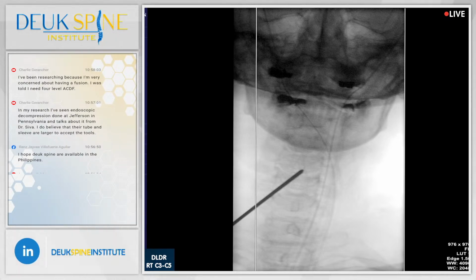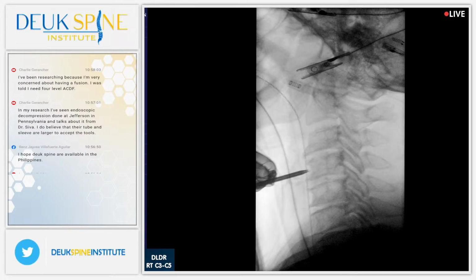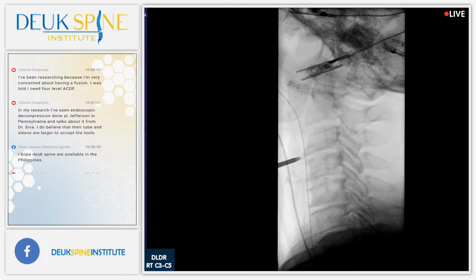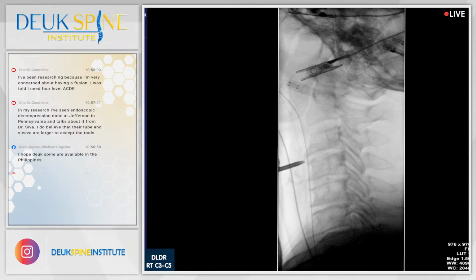Anyway, I learned from them and became probably the 3rd or 4th or 5th anterior cervical endoscopic surgeon. And at the time, Sang-Ho Lee in Korea and Germany were only doing 1 disc at a time. All right? They wouldn't do 2 discs, because they didn't know how to do the second disc. That was a problem everybody had.